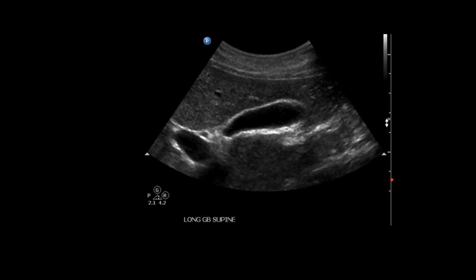In our first image here, we can see the gallbladder is nicely extended, centered in our image. Remember that we've already imaged all of the liver surrounding it, so now we can really focus on the gallbladder itself. We will want our focus at or below the area of interest, which is the gallbladder in this case, reducing our depth again to center on the area of interest. We have a nice crisp border all the way around the gallbladder, representing the gallbladder wall.